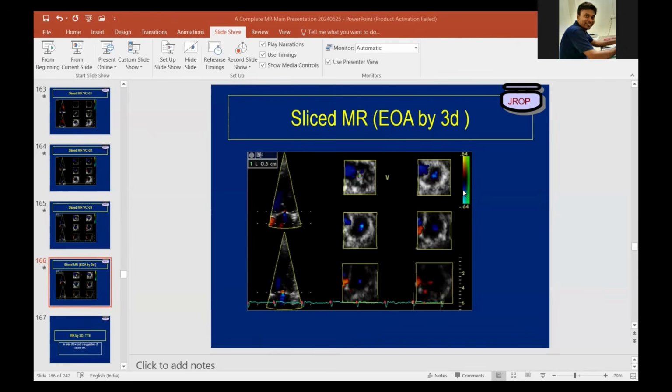Sir, please repeat how we measure a regurgitant volume. Rajan, this is a very simple thing. Look at the flow across the mitral valve. How do you calculate stroke volume across the mitral valve? We measure area and then VTI. Area into VTI. How do you measure area? In the 4-chamber view, annulus diameter. That diameter divided by 2 would be radius, pi r square into VTI. Correct.